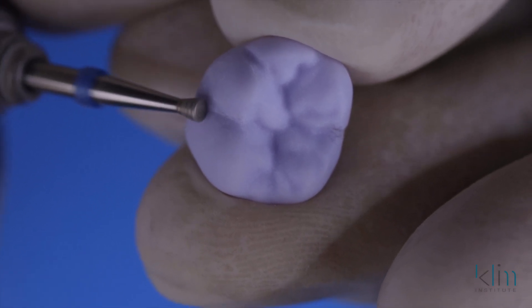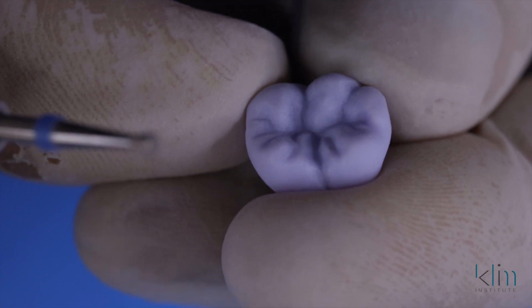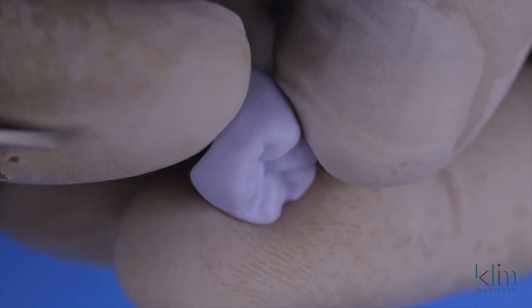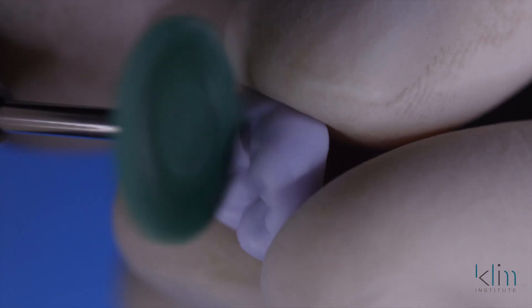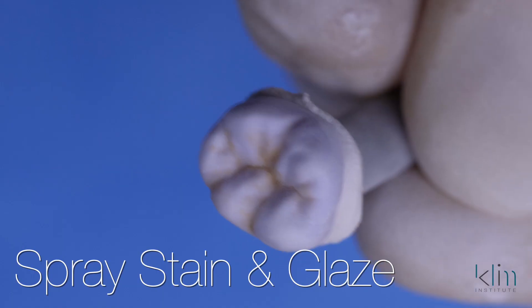The post-shaping of E.max is done after we try it in the mouth to make sure it's going to fit. I go through a very defined sequence of steps in post-shaping. I like morphology, so I'm going to shape the occlusal surface once we cut off that sprue — it's a craft for me. So once we shape that occlusion and get that beautiful morphology, we're going to finish the margins, and then finally we'll do our surface finishing. In this series, we're going to go through polish, brush-on stain and glaze, and spray stain and glaze.